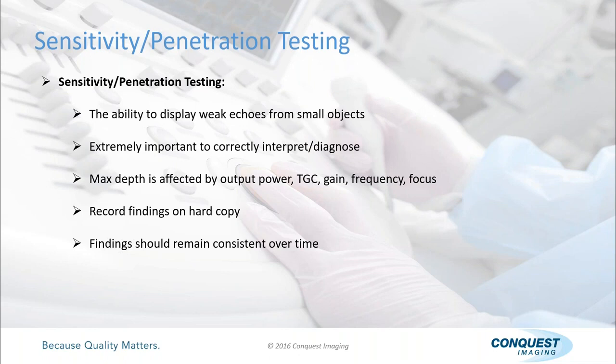But there are auditors out there that will go right to the website and say, it tells you you have to have hard copies left with the machine. So it's up to you. We do hard copies for all our customers that are ACR accredited because we don't want to be called out on it. But hard copy is best.